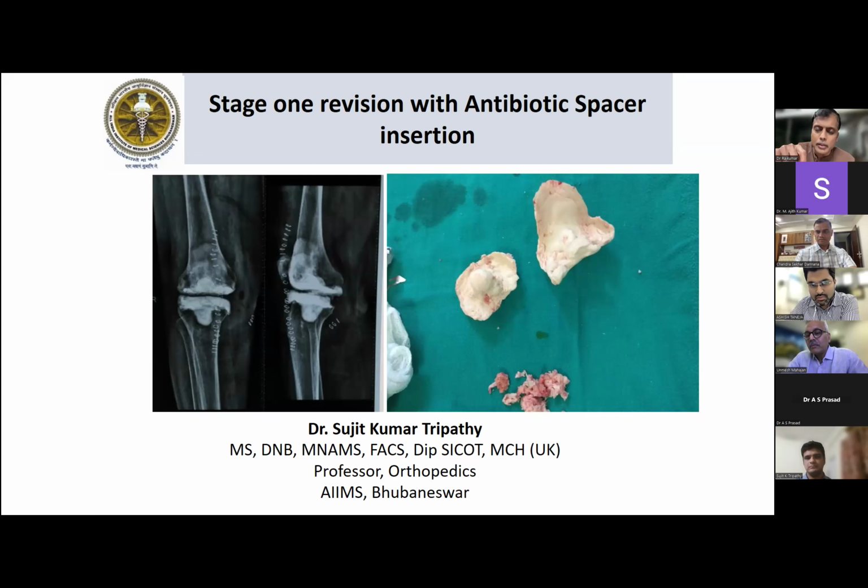Now the good point is we need not rely on the Zimmer cones. Nowadays, in India itself, we have some cheaper cones available, and particularly the sizes are smaller. The problem with the Zimmer cones is that the sizes are very huge. They are for Caucasians. For Indians, the small sizes have come, and that helps us to build that bone.